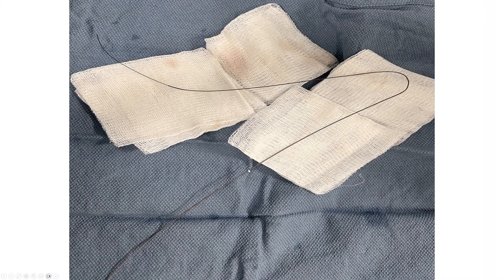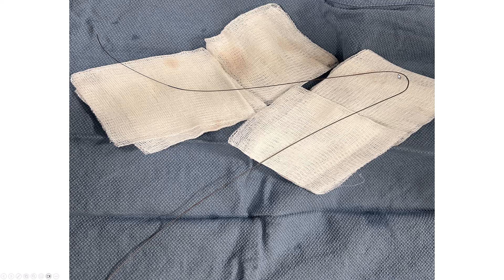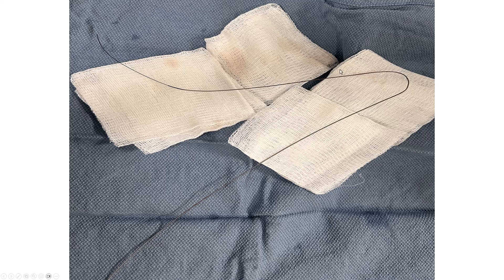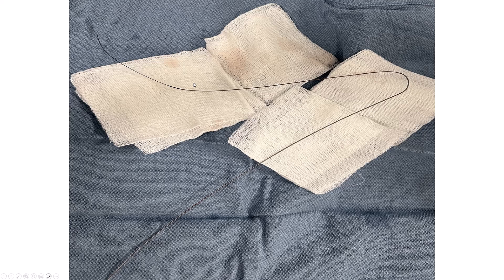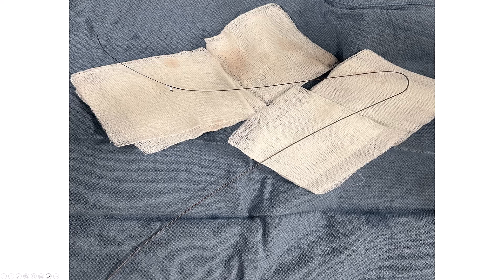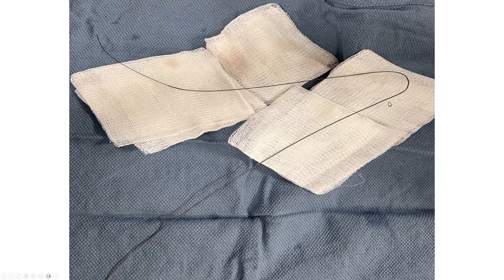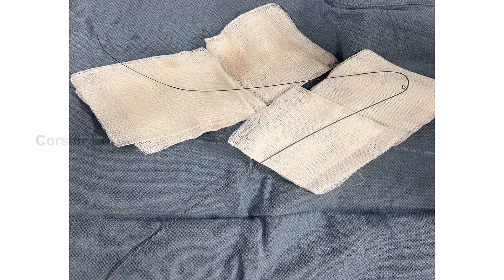This is what came out, and I think it illustrates the mechanism. The problem was that things were kinked — the guide wire inside the microcatheter was kinked — and there was also a lot of friction between the wire and the microcatheter. So it was a combination of factors: wire friction, and a bend in the guide wire that prevented the microcatheter from coming out.